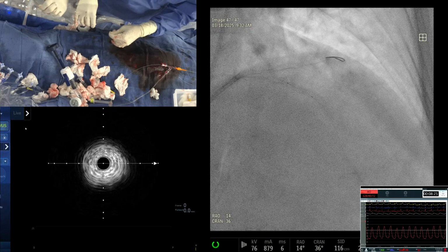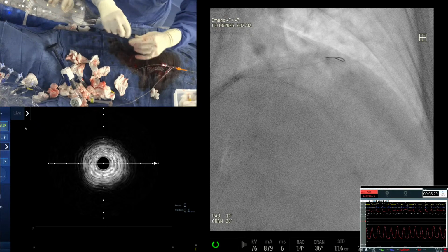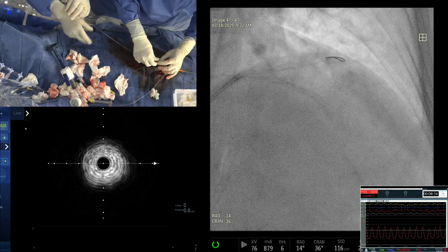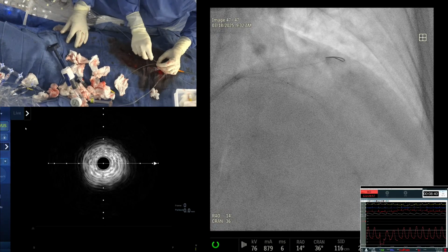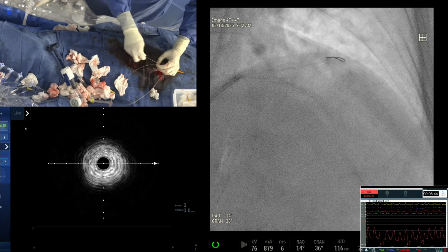We used to carry it, but overall we are not happy, because the key is where your other balloon did not cross, that did not cross either. So we used to keep it. We stopped carrying it now. Many years ago, in live cases, we have used a glider balloon. Yeah, many years ago. So I hope you saw it.